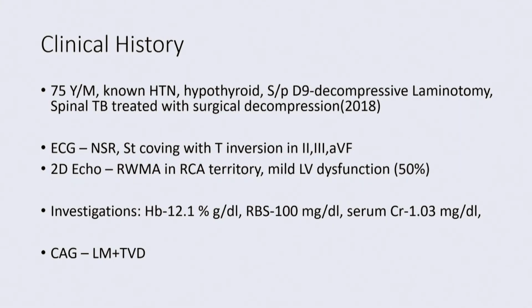Very good morning, hearty welcome to all of you. Today we are showcasing a very nice case of left main bifurcation, which is severely calcified. The patient had a severe right coronary disease with a mid RCA calcified lesion, which was tackled earlier with orbital atherectomy.